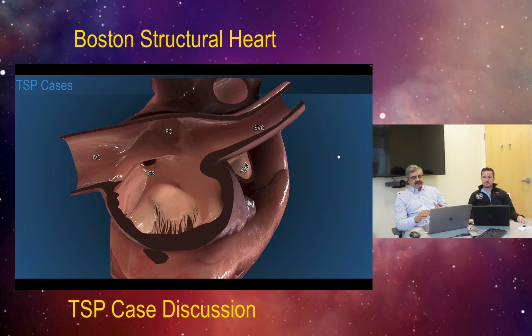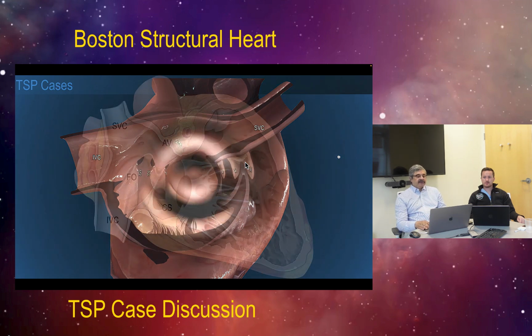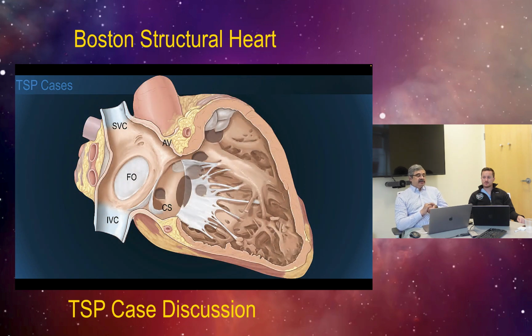Now, this orientation has been addressed ad nauseum by Aidan and myself, so we're not going to go into the detail, but the most important thing that we want to show you is this graphic over here, and that is that superior, inferior, anterior and posterior are kind of arbitrary views that we try to conform to our echocardiographic windows. They're not perfectly orthogonal, so they're not seen exactly in the same locations as we are used to seeing perfectly orthogonal structures. So we already addressed that.